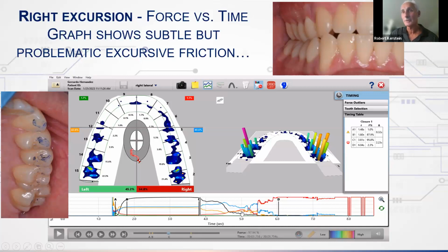So the first one is the orange quadrant. See, it reaches 0% force here, and maybe a little bit more here. But the blue quadrant, it doesn't reach 0% force until here. And that's where the anterior guidance quadrant reaches 100%. And that's where the D line goes.